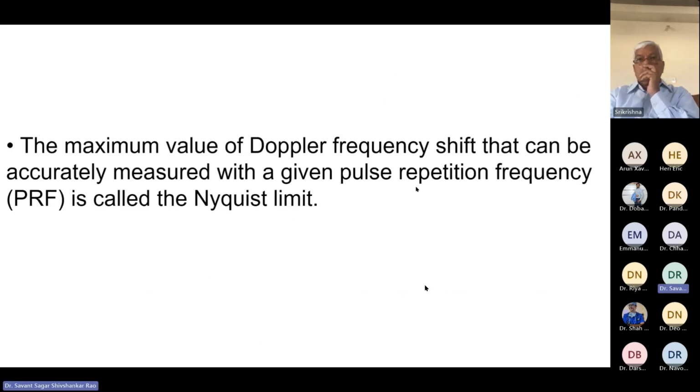The Nyquist limit is the maximum value of Doppler frequency shift that can be accurately measured with a given pulse repetition frequency.